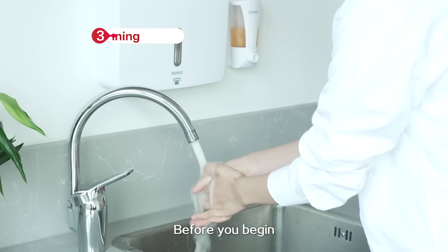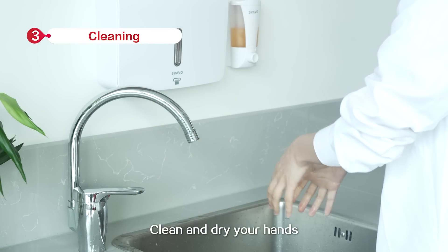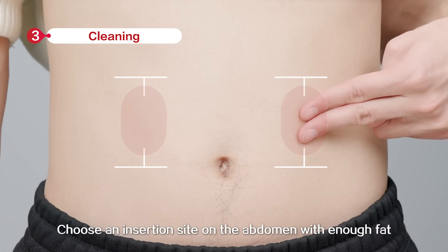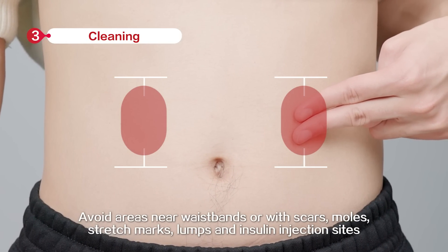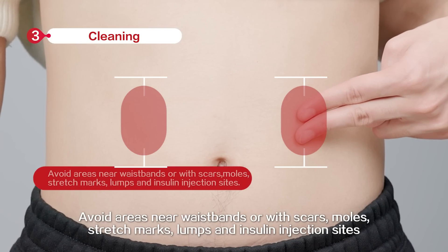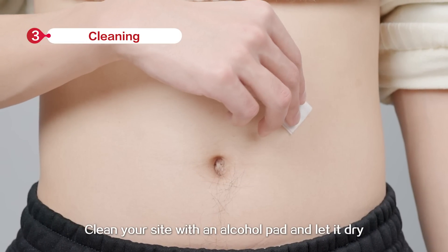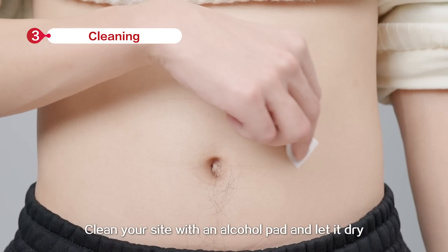Before you begin, clean and dry your hands. Choose an insertion site on the abdomen with enough fat. Avoid areas near waist bends or with scars, moles, stretch marks, lumps, and insulin injection sites. Clean your site with an alcohol pad and let it dry.